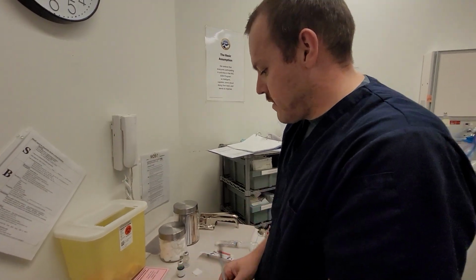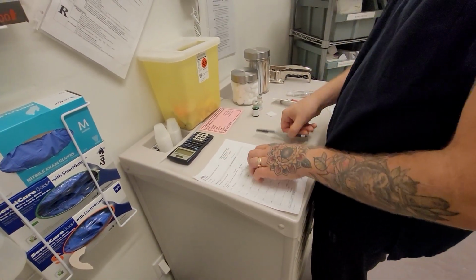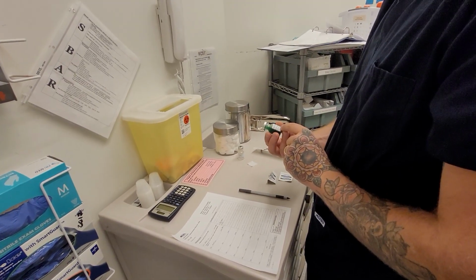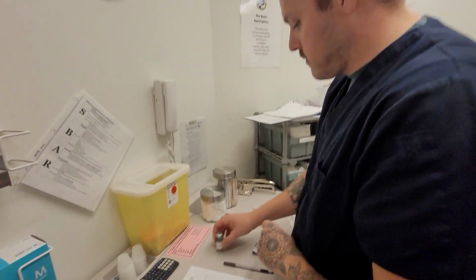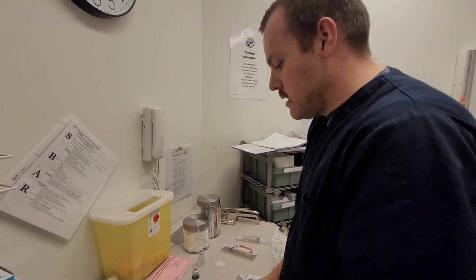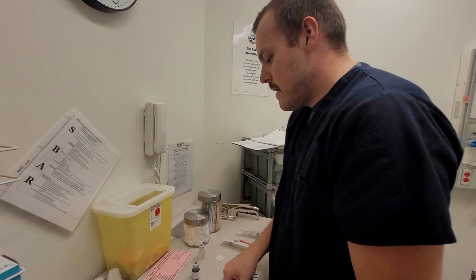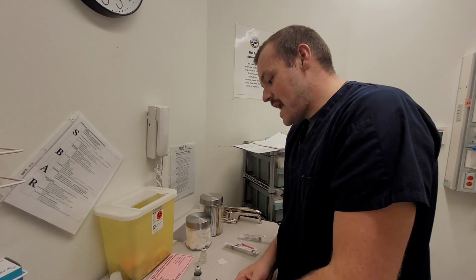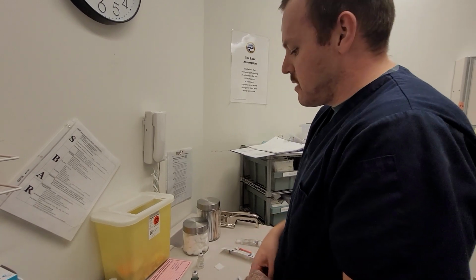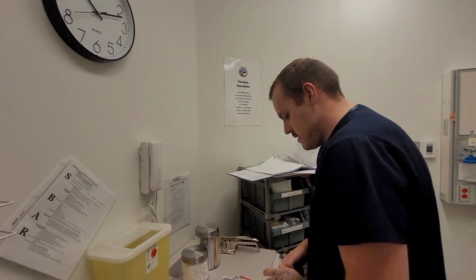We're going to go through our 7 rights of medication. So is this the right patient? We've got our MAR here. We're going to cross-reference with 2 patient identifiers at the bedside. Our drug, we've got naloxone, 0.4 milligrams, expires 12/20/35, and our mix is normal saline, not expired. Dosing, we're 0.1 milligrams. We've established our med math, that's 2.5 mils. Time, it's a stat medication. And route, we're going to be giving an IV. Reason, because this is going to be a reversal of respiratory depression, and we're going to provide the right documentation.